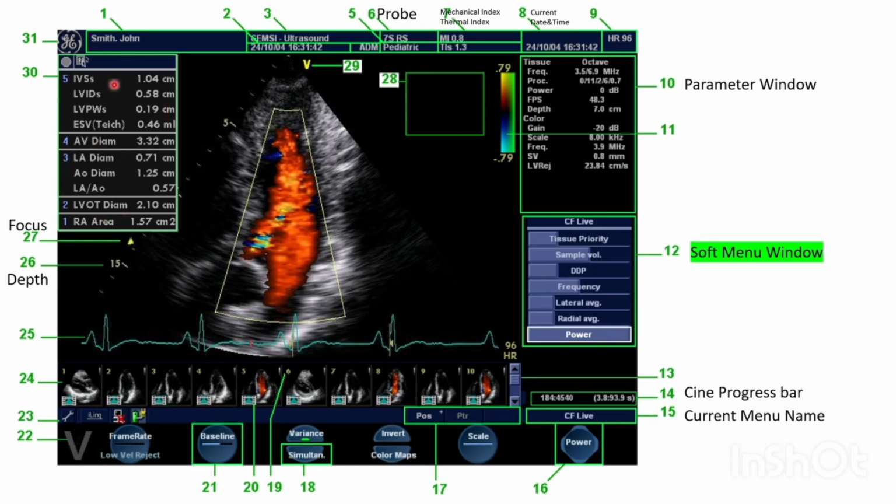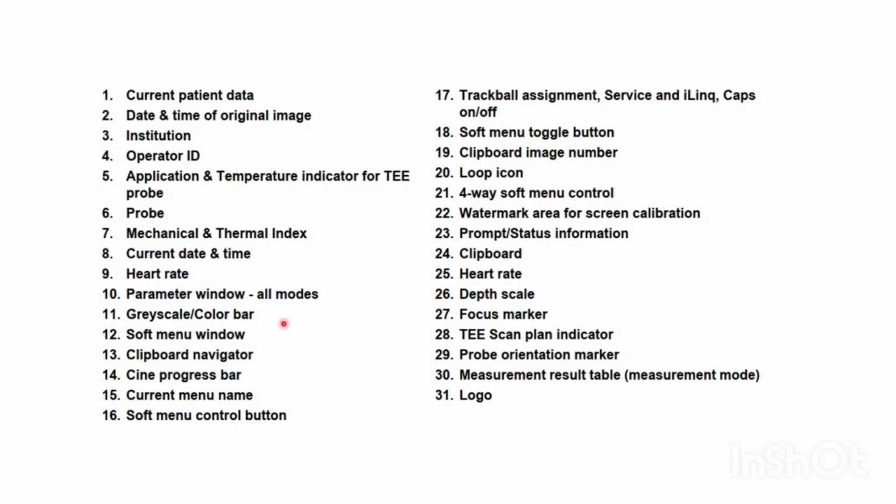On this left banner, we have the measured parameters, which we have got after making this. I hope everybody knows: interventricular septum, IVS in systole, internal diameter in systole, posterior wall in systole, etc. This is the ECG, and various clips which I have said come here. Here the settings come. We can change various parameters, for which we have to take the mouse and click here. We'll get various parameters here. The network will be displayed here. The power and the battery status will be displayed here. So this is a brief introduction of the Echo monitor window, how it appears, and we'll go into detail later.